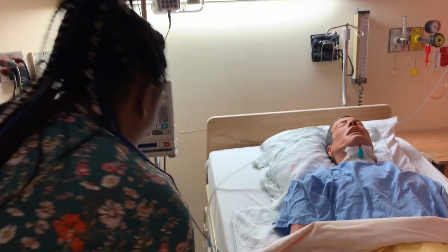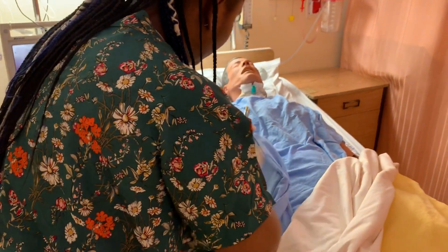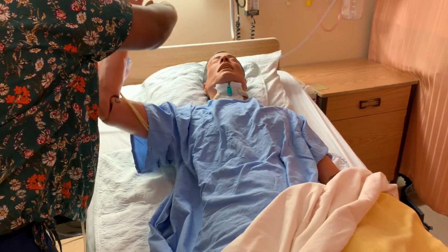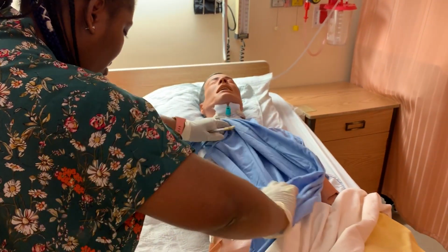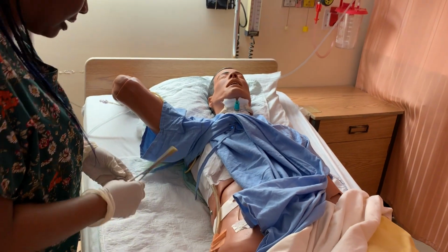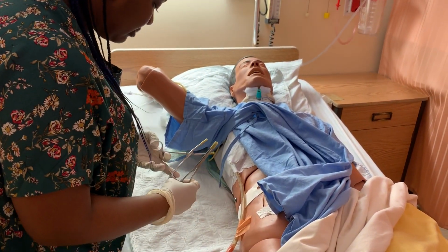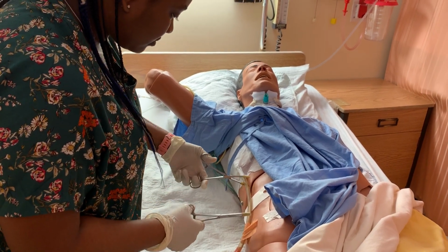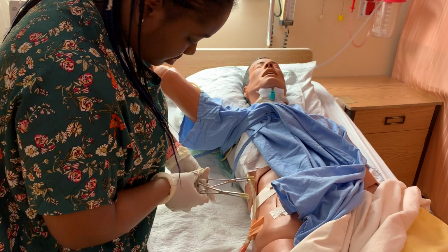Yeah, I have my clamping forceps, so there's bubbling there. So I'm just gonna go up to my patient. I'm gonna raise his arm here a bit, just to have access. So now I'm gonna clamp. So for me to clamp, I can clamp this from here. I'm gonna clamp it.